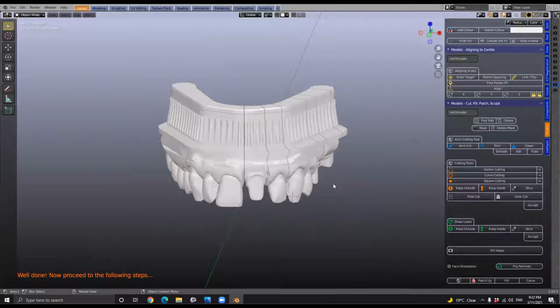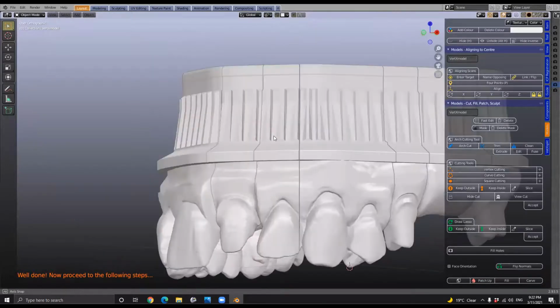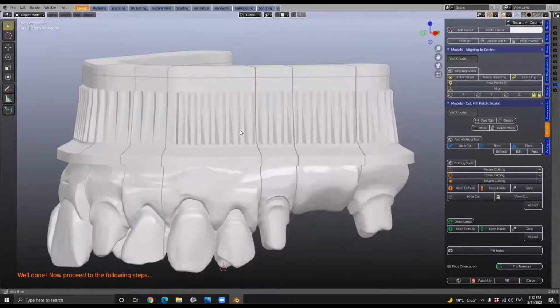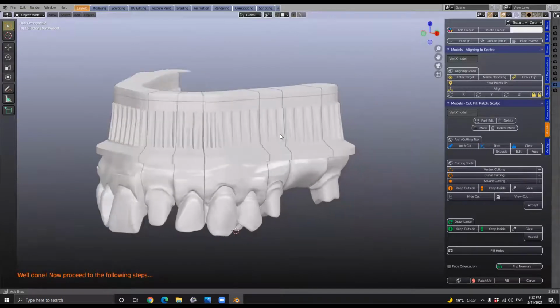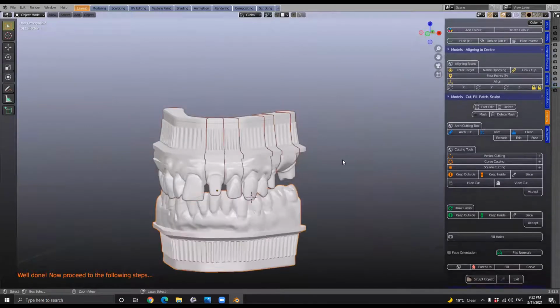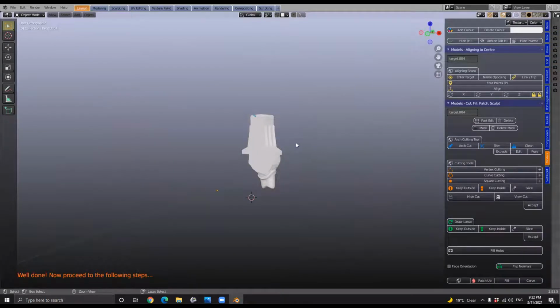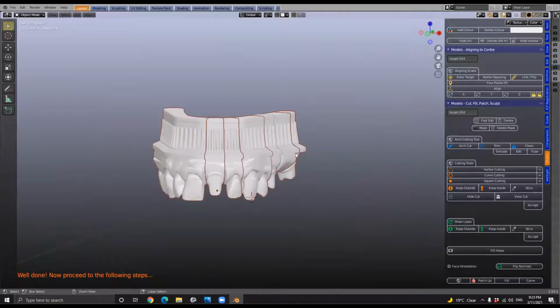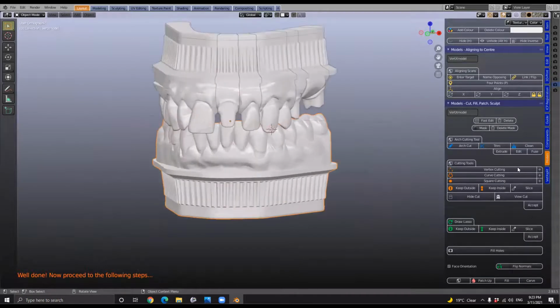No questions? Guys, how deep are those grooves? Is it possible to lower the model? I'm just thinking of saving resin as much as anything else, if you can hollow this whole structure. Okay, let us go that way. I'll see if I can go back far enough or not. I'm not sure. Yeah, we can do it to the lower actually. So let's see what that looks like if we hollow this.